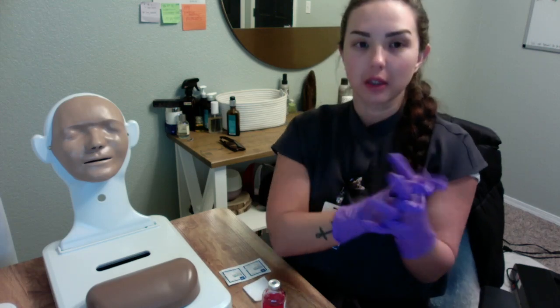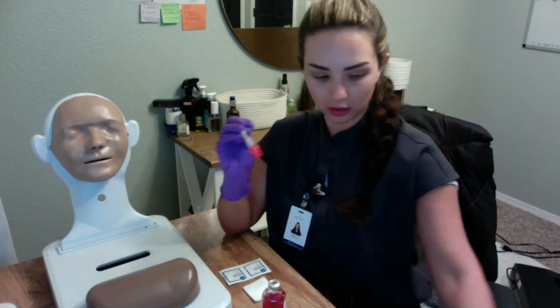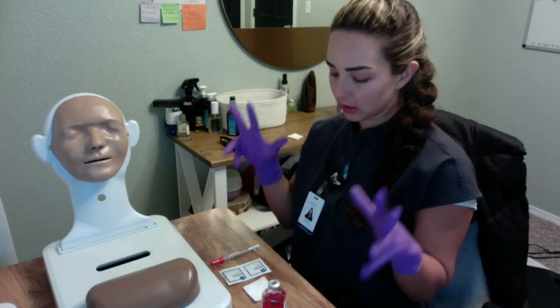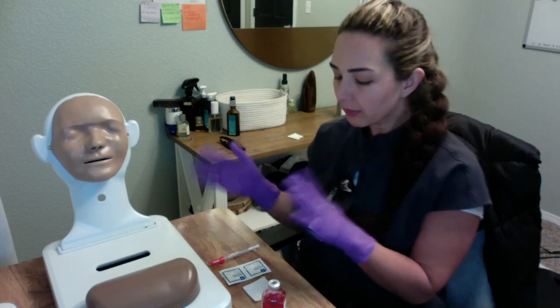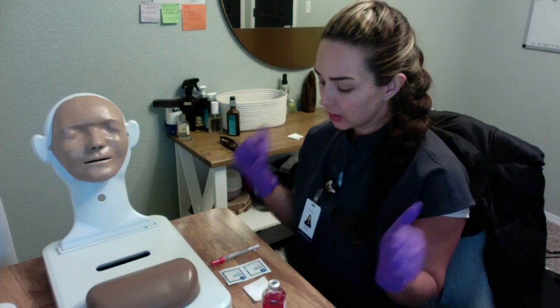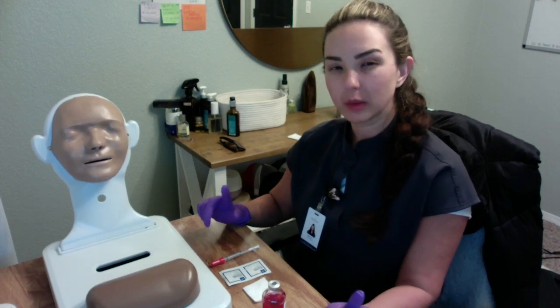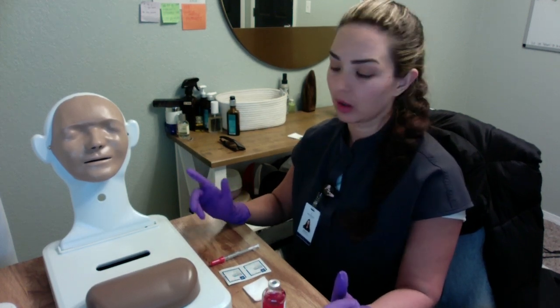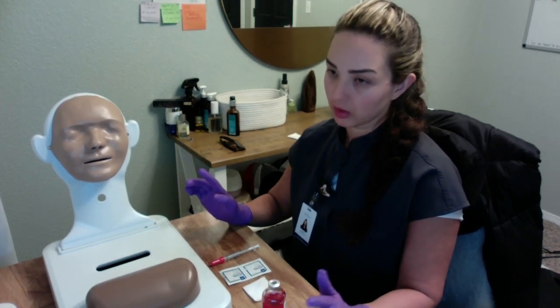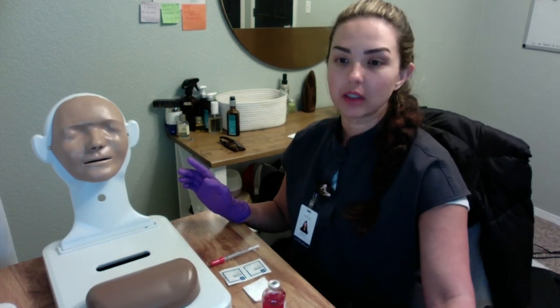Okay, so we've got our syringe here. We want to verify the medication one more time to the MAR and our dose. So again, 0.1 ml, single dose. We always want to allow our patient to ask questions too. So when I'm done explaining medication, side effects, and adverse effects, we certainly would ask her if she had any other questions. So I did miss that.